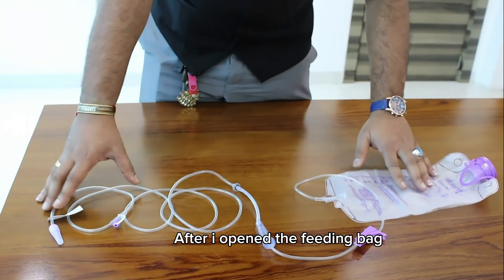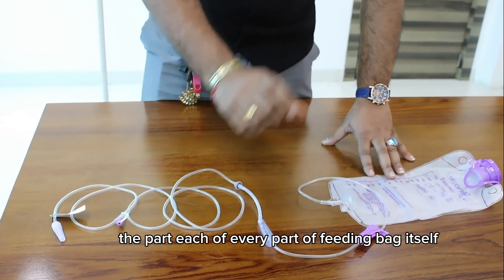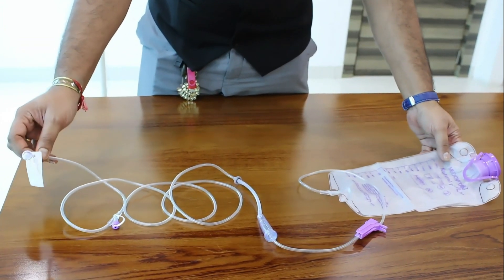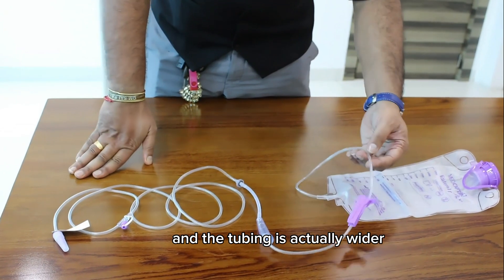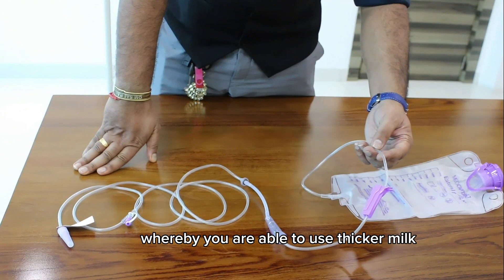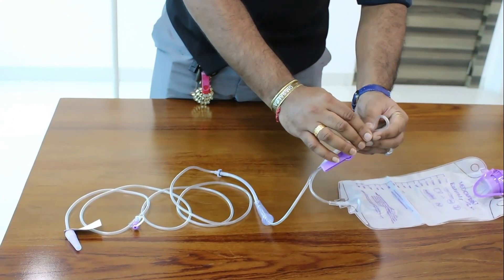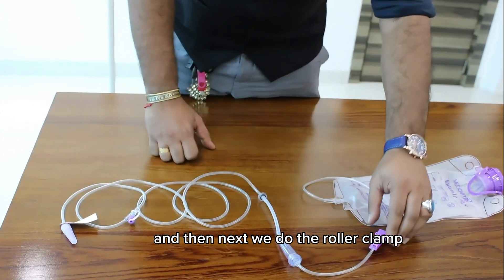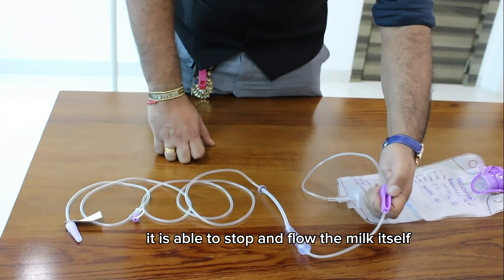After opening the feeding bag from the packaging, I will now show you each and every part of the feeding bag. First, the tubing — the tubing length is 260 cm and it is wider, allowing you to use thicker milk. The tubing is also kink-resistant, so it does not bend easily. Next, we have a roller clamp that is able to stop and control the flow.